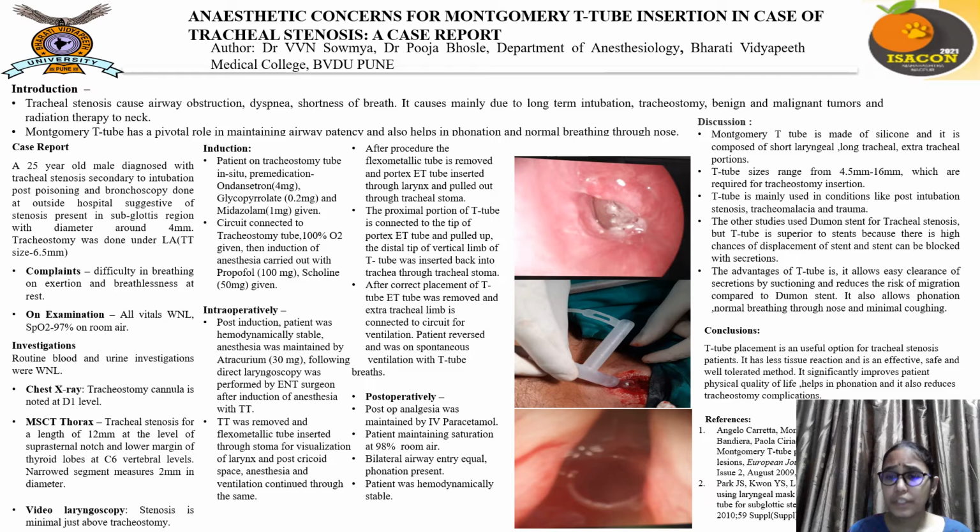Conclusions: T-tube placement is a useful option for tracheal stenosis patients, and it has less tissue reaction and is an effective, safe and well-tolerated method. It significantly improves the patient's physical quality of life and helps in phonation, and it also reduces tracheostomy complications.